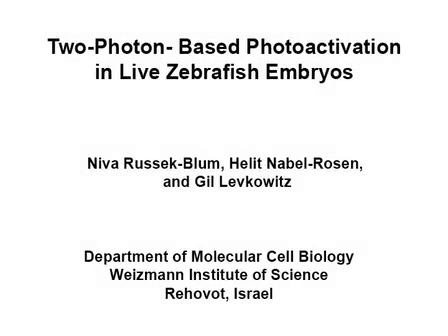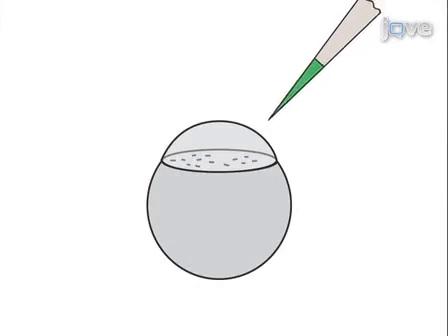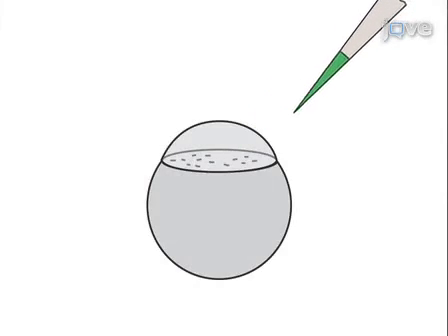The overall goal of the following experiment is to photoactivate a given light-responsive agent, such as chemically caged fluorescent dye, in a live zebrafish embryo at a single-cell resolution. This is achieved by injecting a light-responsive agent into one-cell stage embryos expressing a live genetic landmark to locate and precisely target any cells of interest.